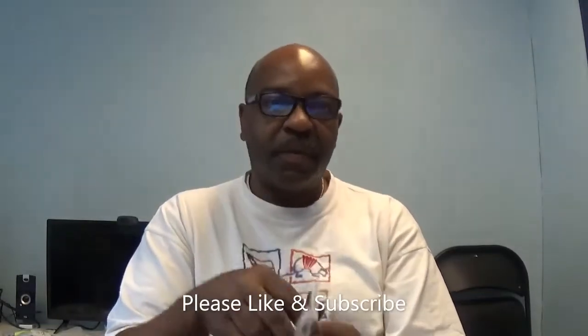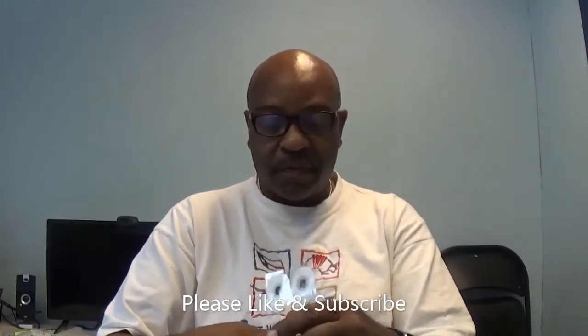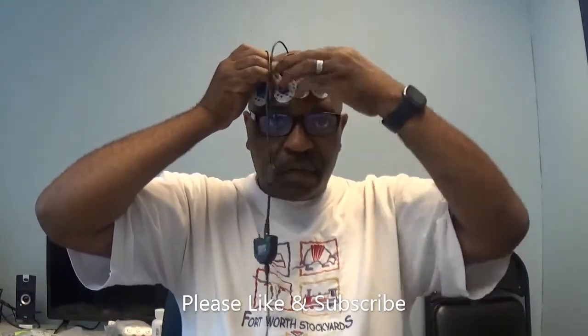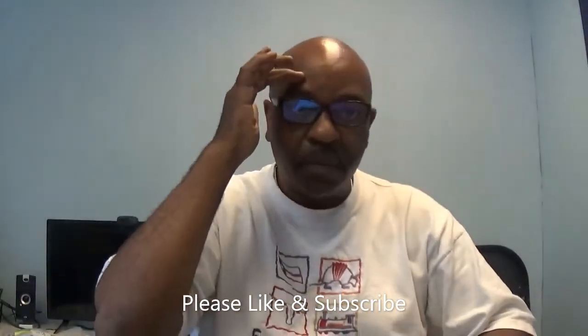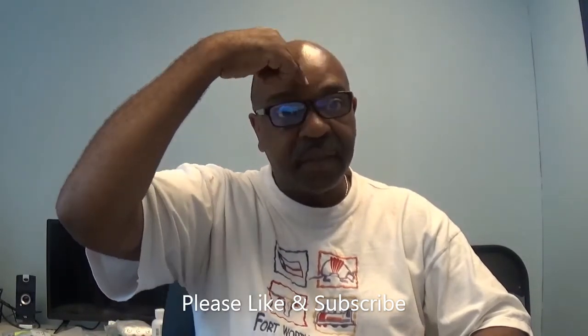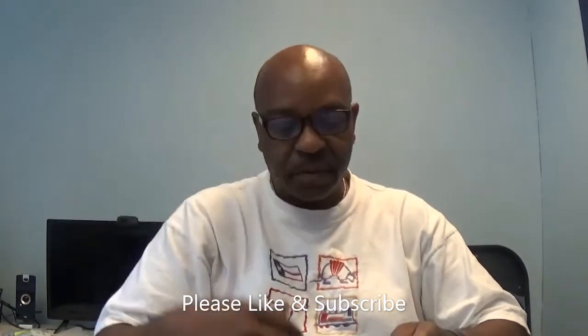Alright, so now we would peel these off and we stick one on at a time. So placements that I would use this for, I might put them on the forehead. So I would have 3 going across the forehead like so. We'd have these 2 and this one. We would just have 1, not all 4. So it'd be 3. And what I do is I put the active ones right over the eyebrows, over the eyes, and then the ground or reference would go over the nose. So you just have 3 straight across.